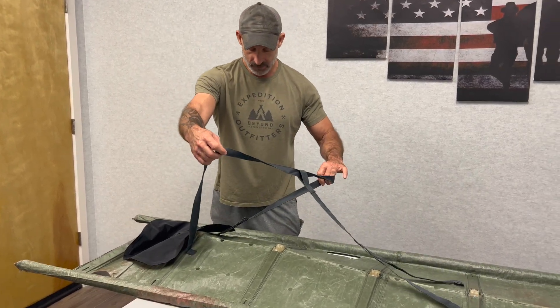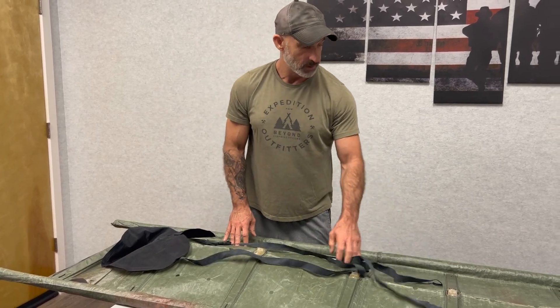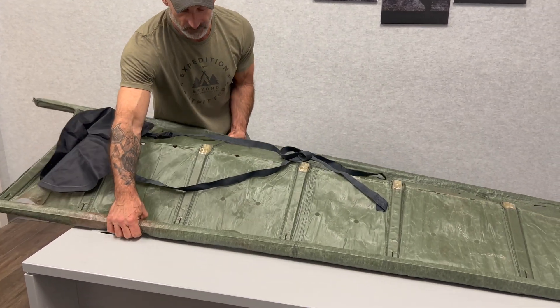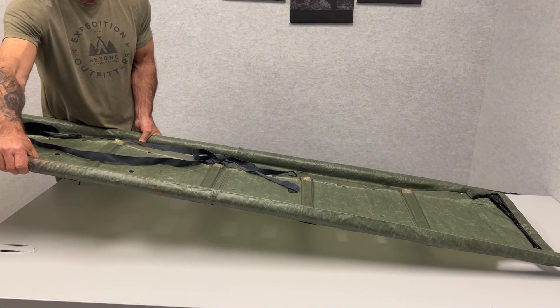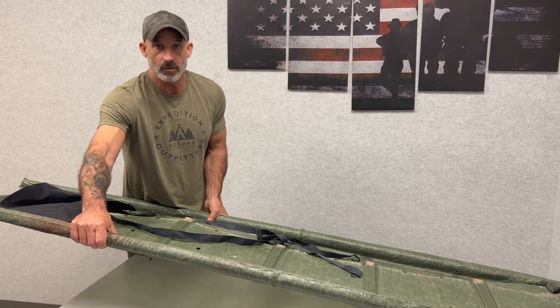Here we have Kevlar straps and Fast-Tec buckles that hold the patient in. As you can see, there are some rigid beams that fold, but when you lay it flat and put weight onto it, it becomes rigid. You have a fully rigid stretcher that's capable of holding 400 pounds.